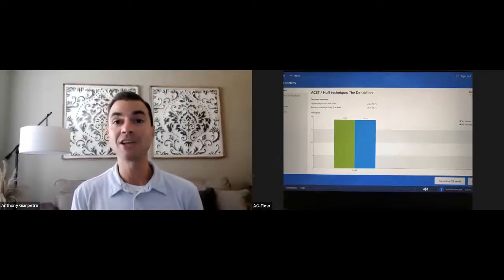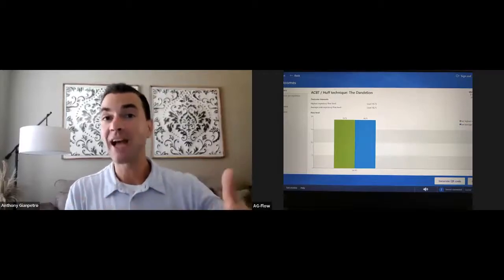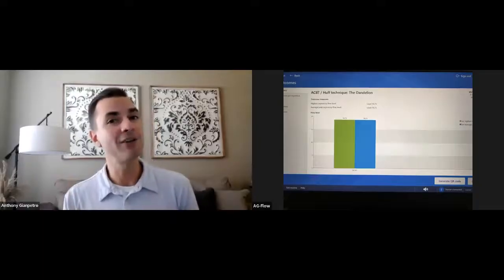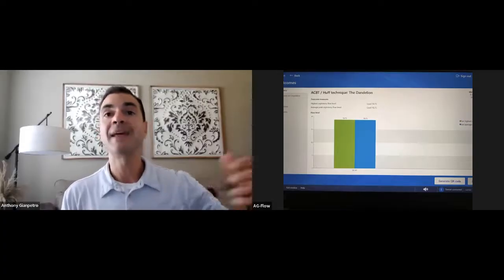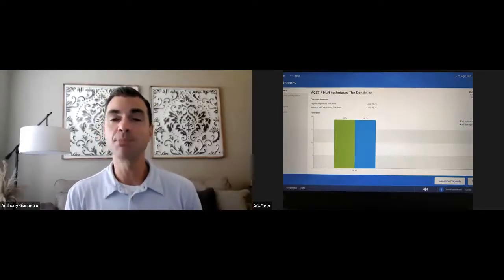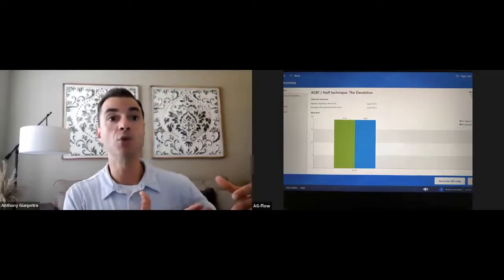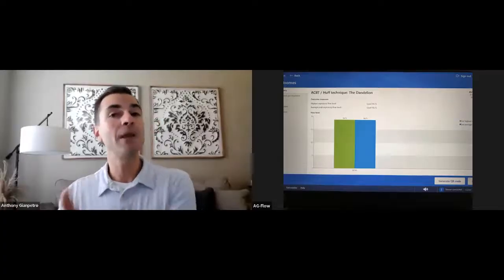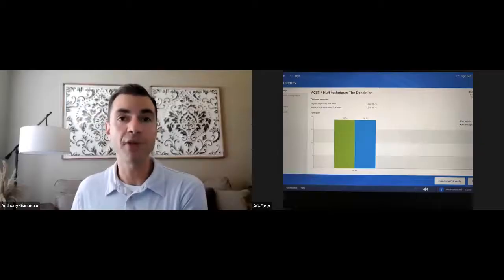And I find that patients with the virtual augment, they'll start challenging themselves even, where before they realize they only got to level 10. Now can I get to a level 11 or 12? Or some patients you might find before you put them on some type of aerobic trainer that they struggled with it and they didn't like it at first. But if you help them clear their airway, maybe with Dandelion, or if you help them do the Diamond Mind for 10 breaths before, it's now easier to handle that aerobic task or even that gait training or ADL that you have planned for them.